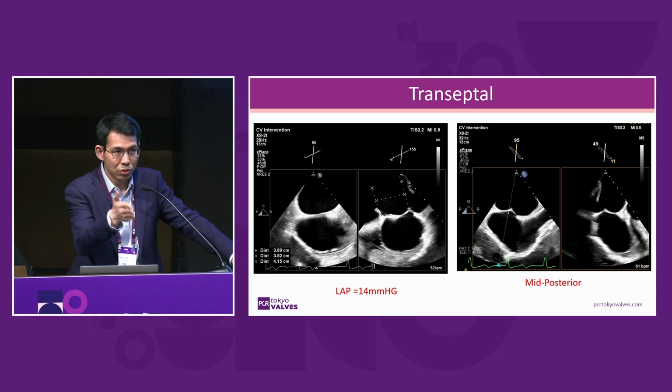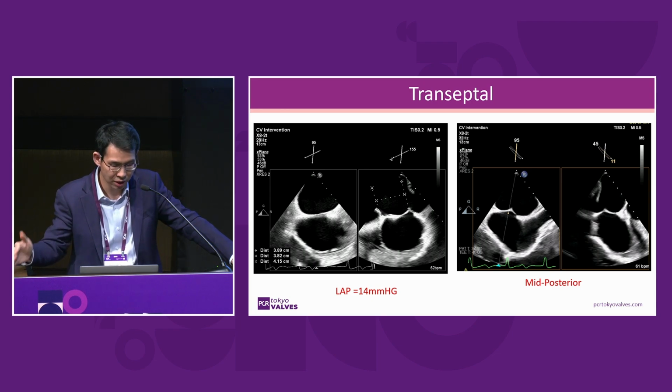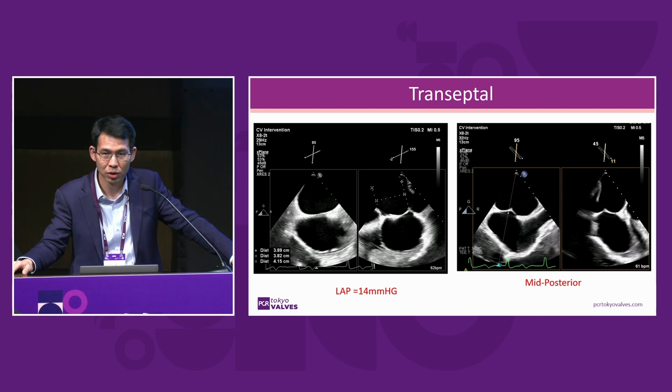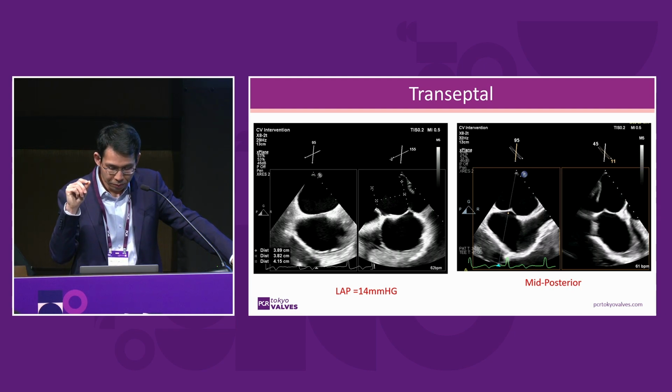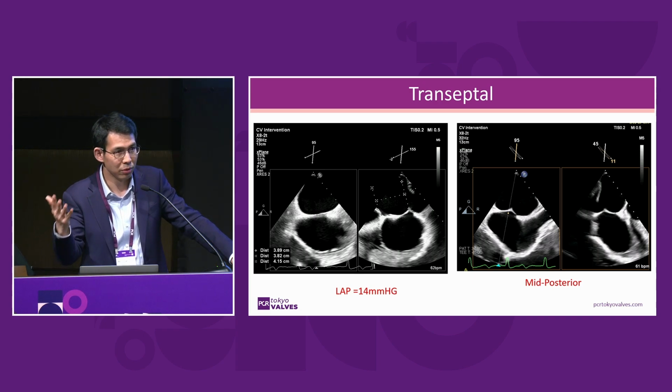For this lateral commissure, the height that we need from the mitral valve is not so demanding. So in this case, we actually take a 4.1 centimeter height from the mitral valve. The other important issue is, if we are doing an isolated left atrial appendage occlusion, the optimal transeptal position will be an inferior posterior location. But most of the time, the posterior transeptal puncture is important, and the inferior, especially in those reverse or chicken wing morphologies, will be very important.